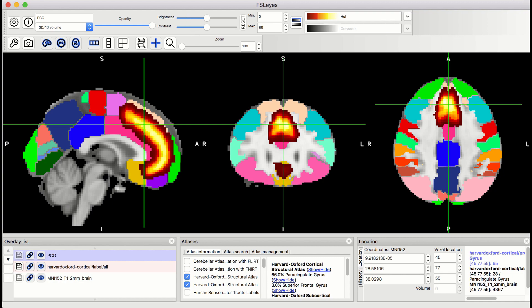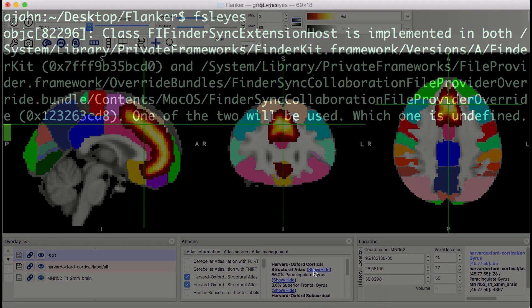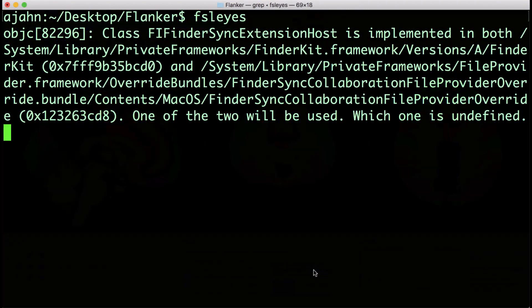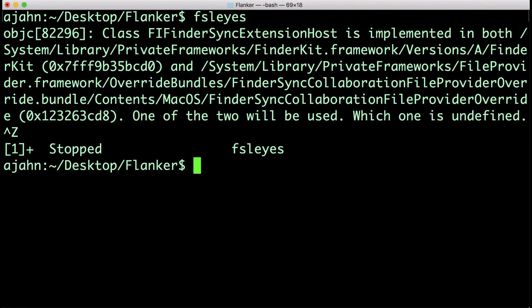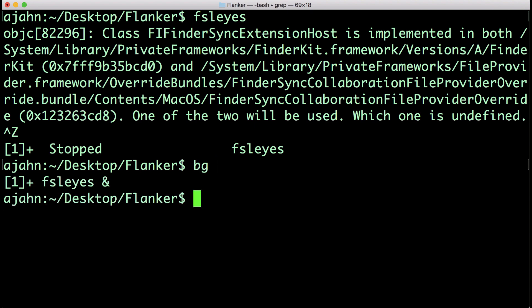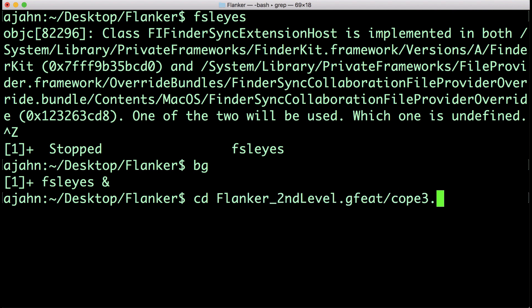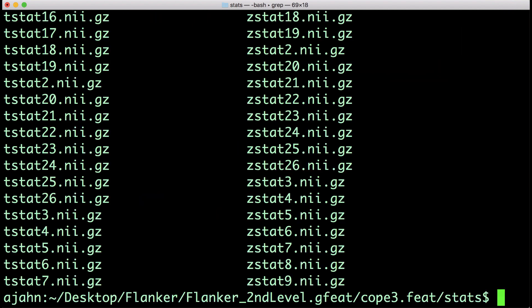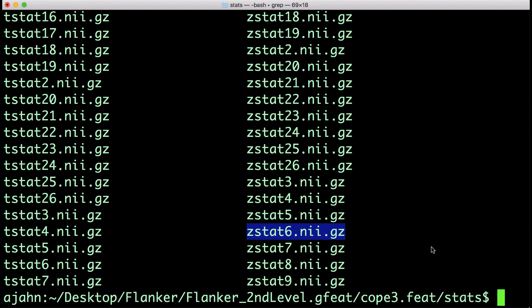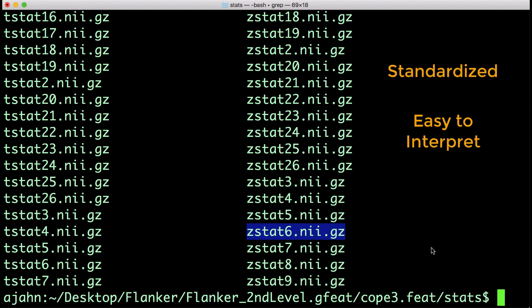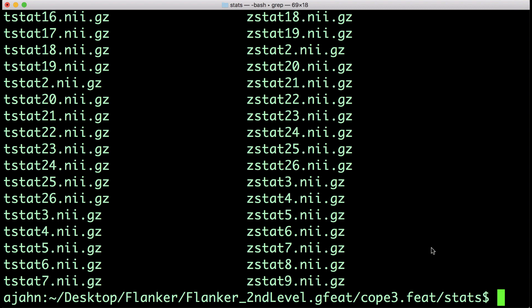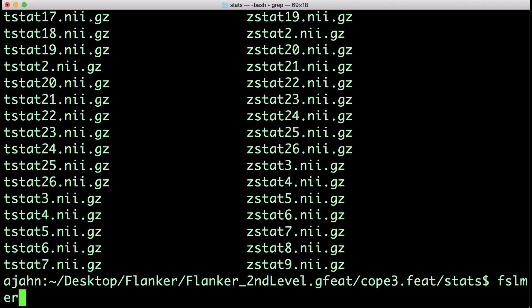Once you've created the mask, you can then extract each subject's contrast estimates from it. For the incongruent minus congruent contrast estimate, for example, you can find each subject's data maps in the directory Flanker secondlevel.gfeat cope3.feat stats. My preference is to extract data from the z-statistic maps, since they are standardized and easy to interpret. We will need to merge all of the z-statistic maps into a single data set.